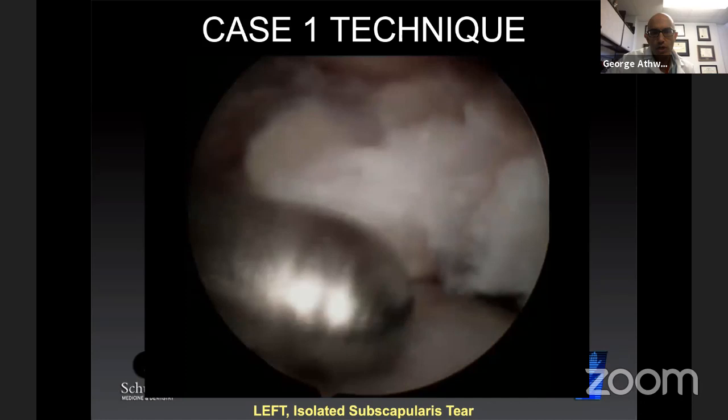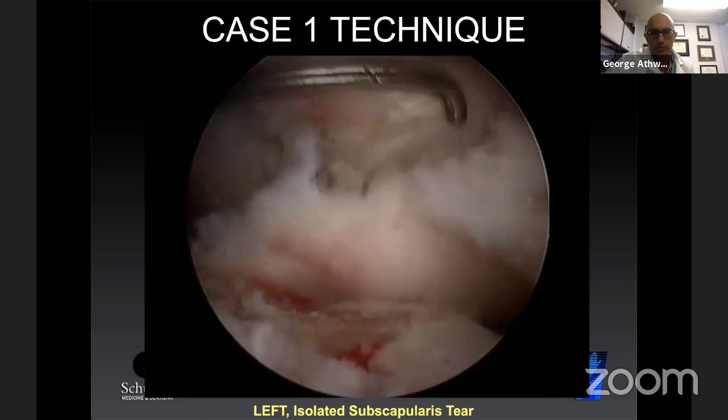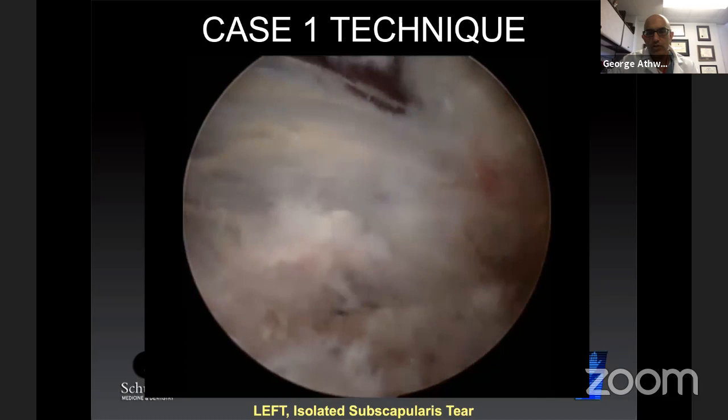In circumstances like this, where there's a complete isolated subscap tear, I'm typically going to use three anchors. I'm going to place one down very low, one in the middle, and one up high. So typically a three suture anchor repair for a full thickness subscap.